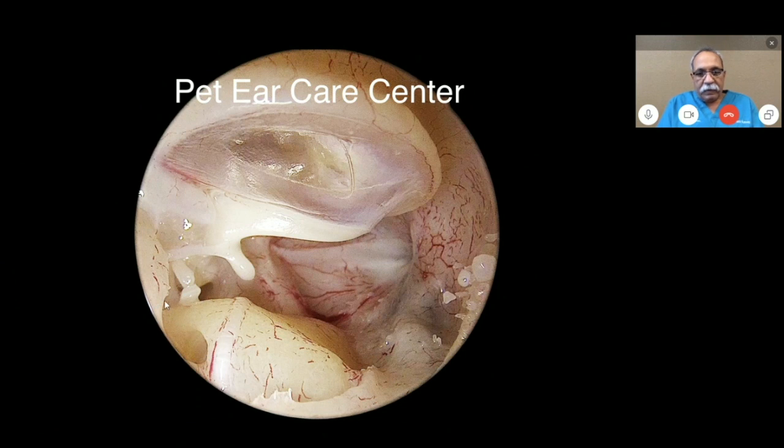Then on the far right, in front of the tip of the malleus, is the eustachian tube opening. The little darker area where the cursor is pointing, that is the jugular bulb. You have to be careful with anatomy when you are in the middle ear. And on the far right side are the spicules. So this is what you are going to see with the endoscopic view.